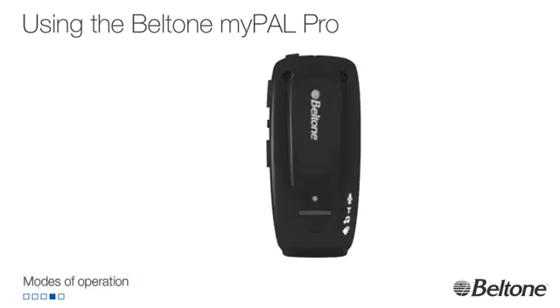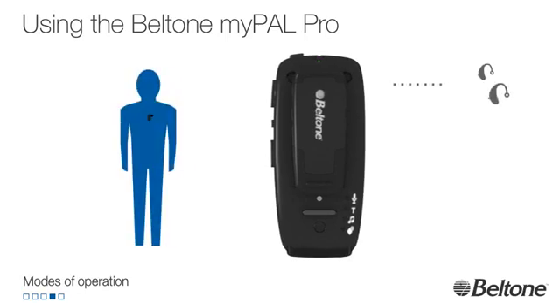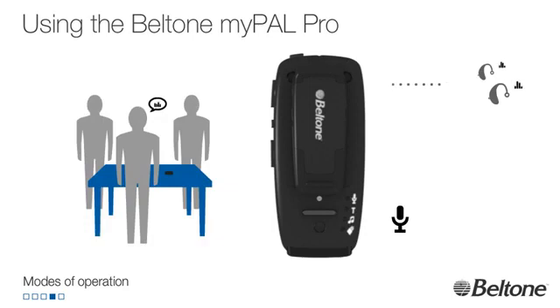Text, modes of operation. An image shows hearing instruments connected to the device. An arrow points to a green light at the base of the device and a microphone icon. A group having a conversation connects to myPAL Pro and hearing instruments.